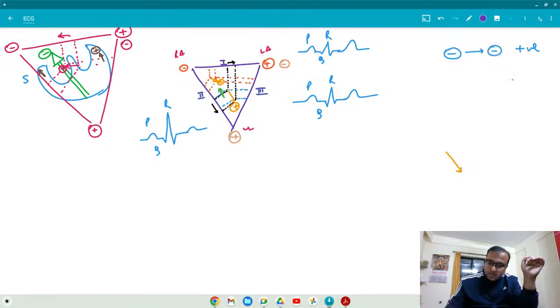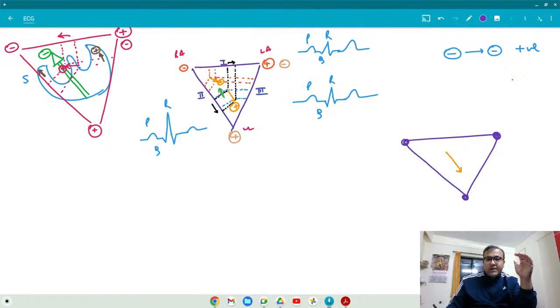I don't think it is difficult. You are doing well. You remember, the augmented leads are located in these areas: AVR, AVL and AVF.